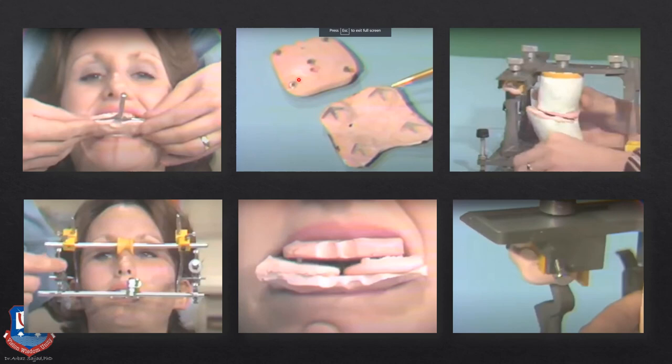After this, in the second picture, what you see are something called clutches, which are made out of composite or resin material. These clutches are then attached to the upper and lower record bases, and the upper clutch has these five studs or styli, and it makes the diamond shape or the typical arrow tracing for the protrusive, centric, and laterotrusive guides or the mandibular movements.